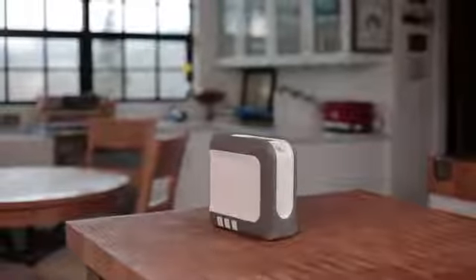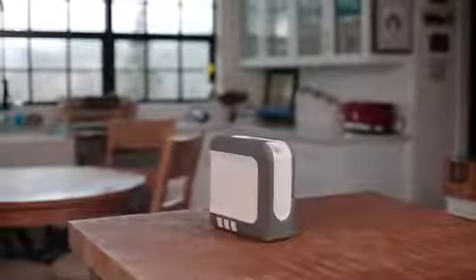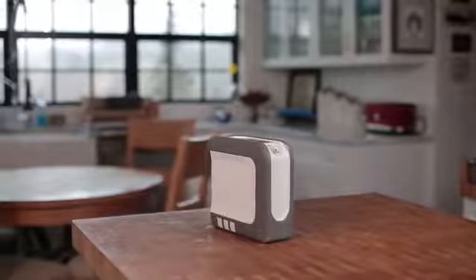Welcome to the iGoTo. Today we'll review the essential parts that are included with your iGoTo portable oxygen concentrator.